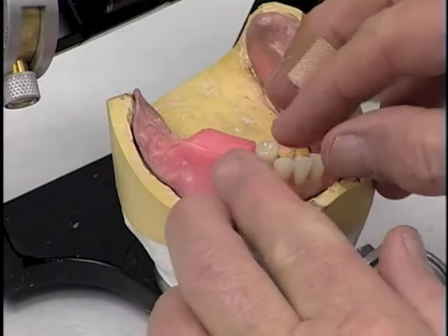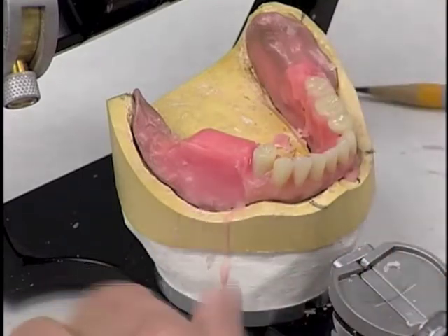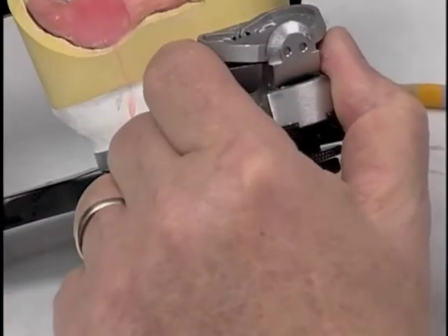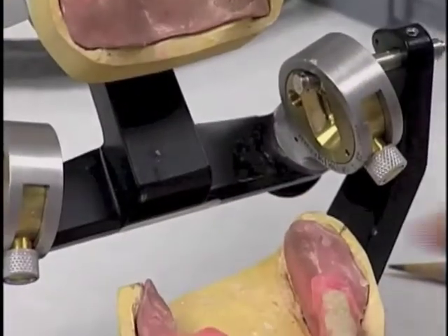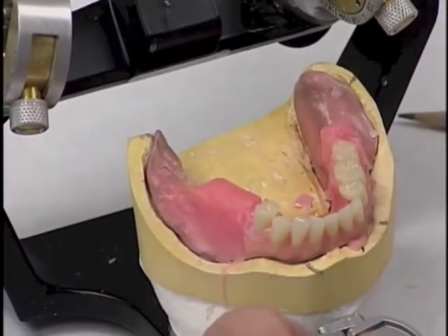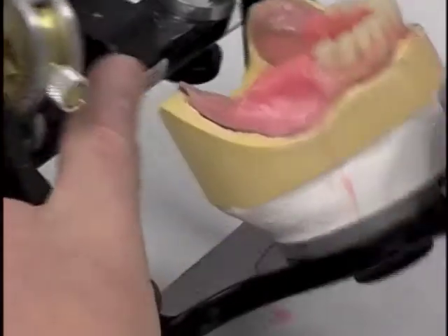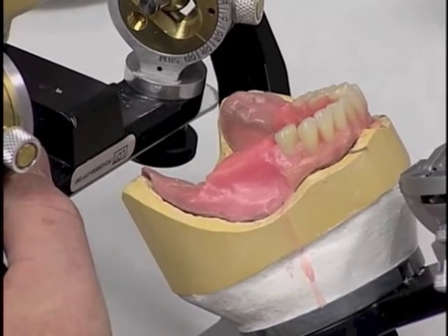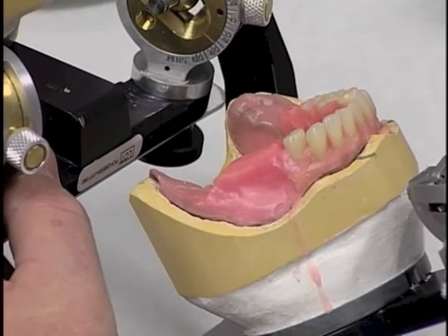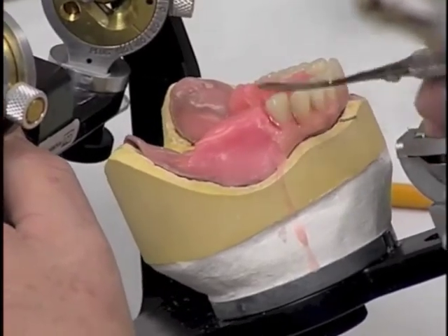And we place the tooth keeping the buccal cusp in alignment with the anterior arrangement, checking it with our flat plane occlusal plane guide, and see to it that both buccal and lingual cusp touch the occlusal plane guide. Once that is in position, we're going to stabilize that tooth just a little bit by melting some wax around it, allowing that tooth to stabilize so it doesn't tend to move on us.